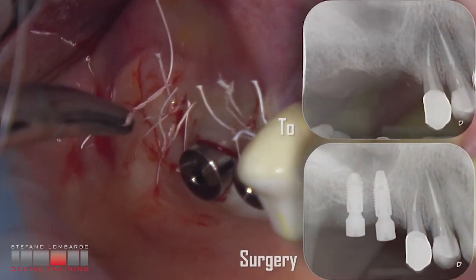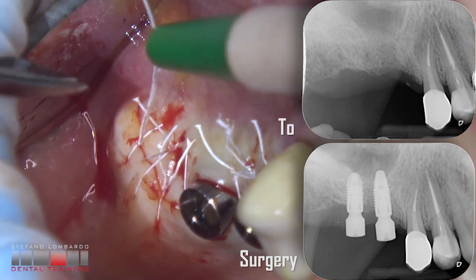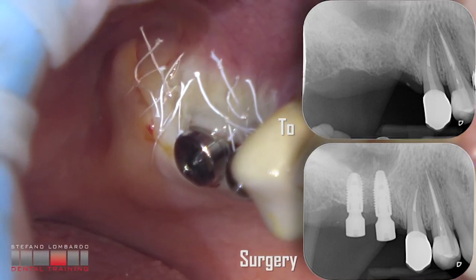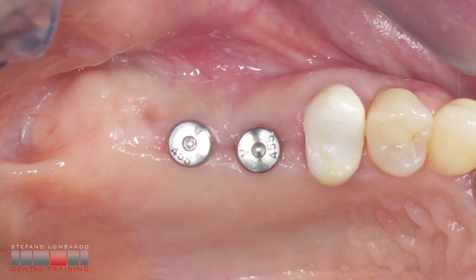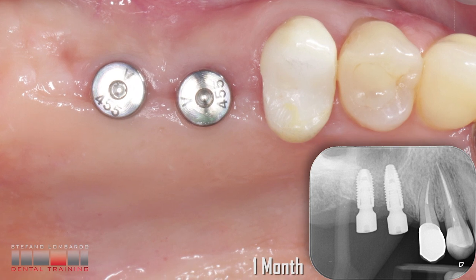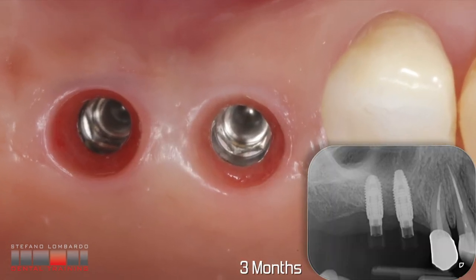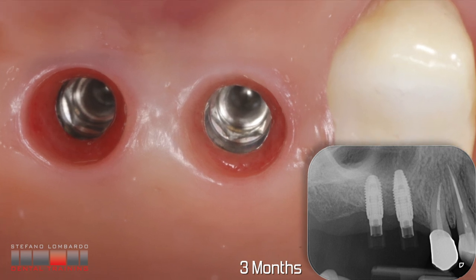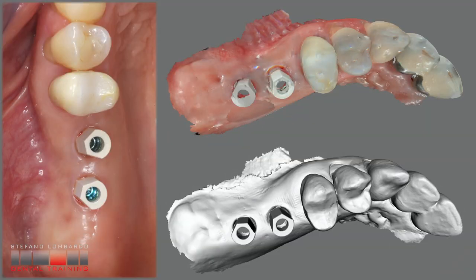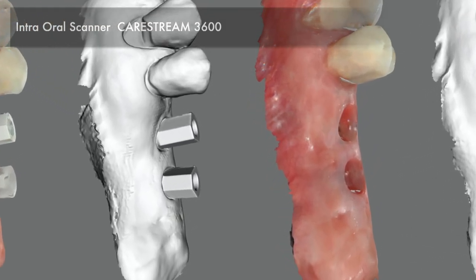The x-rays show the preoperative situation and that of the day of surgery. Soft tissue healing after 1 month and partial mineralization of the grafted areas. After 3 months, almost complete mineralization of the grafted areas, and the intraoral scan with the Carestream for the prosthesis of the 2 elements.